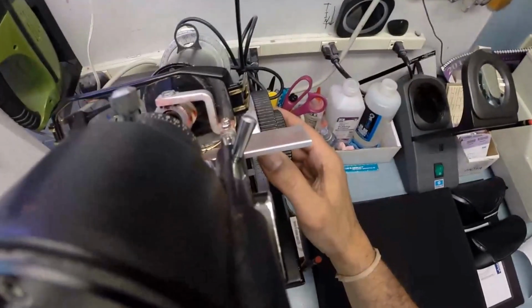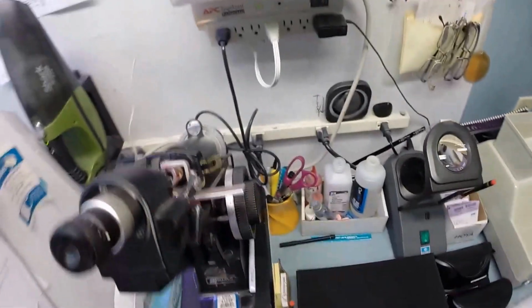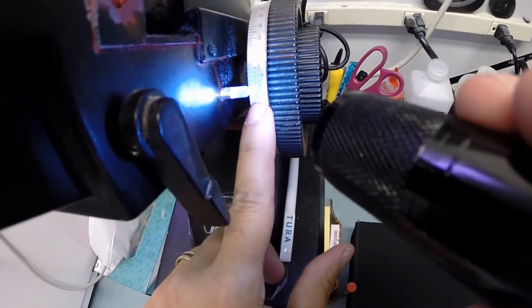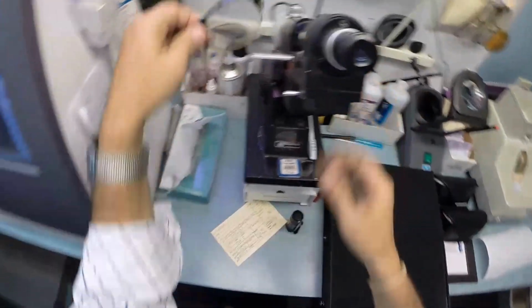So let's go ahead and check the second curvature on your lens. Sorry, let me get in there quicker. And that's where we're at, 50 cents in the red, exactly halfway between 0 and 1. So that is cut perfectly. I couldn't have done this any better if I had done it myself.